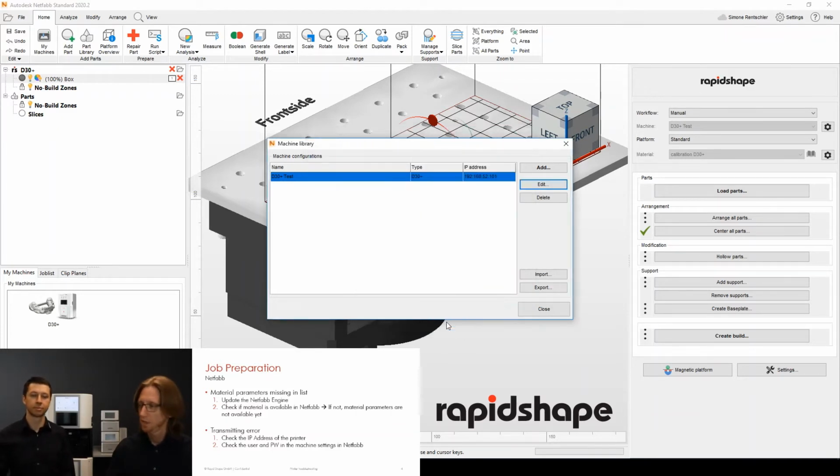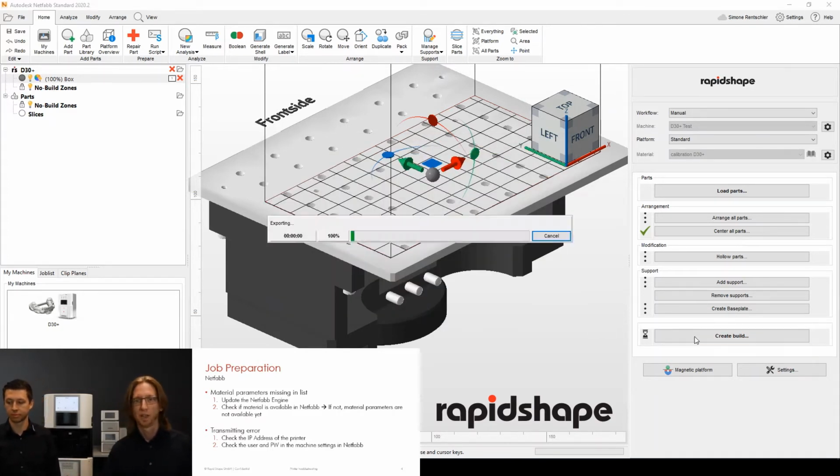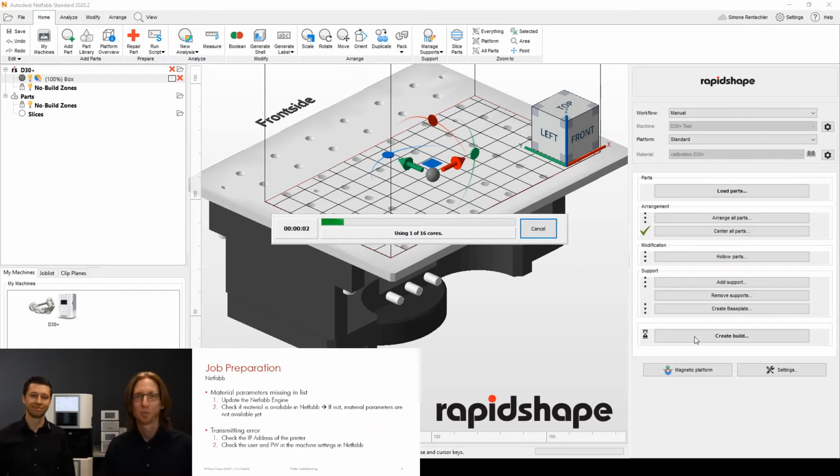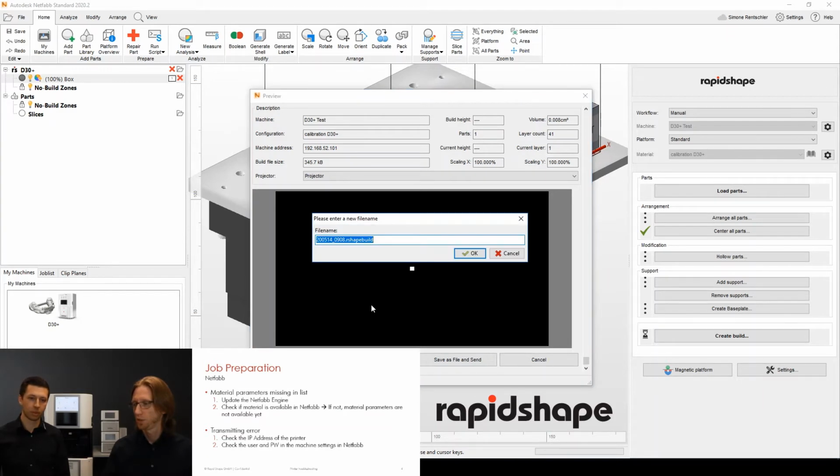Let me save the changes we have done here, and let's just try again. So I assume and I hope that the job transfer will work now. Again, we have a fairly quick slicing process because of a small part. Let's see what will happen, and let's just send it to printer. And as you can see, when you see this window with the option of entering a certain file name, then you can be sure that the information transfer or the job transfer is working fine.